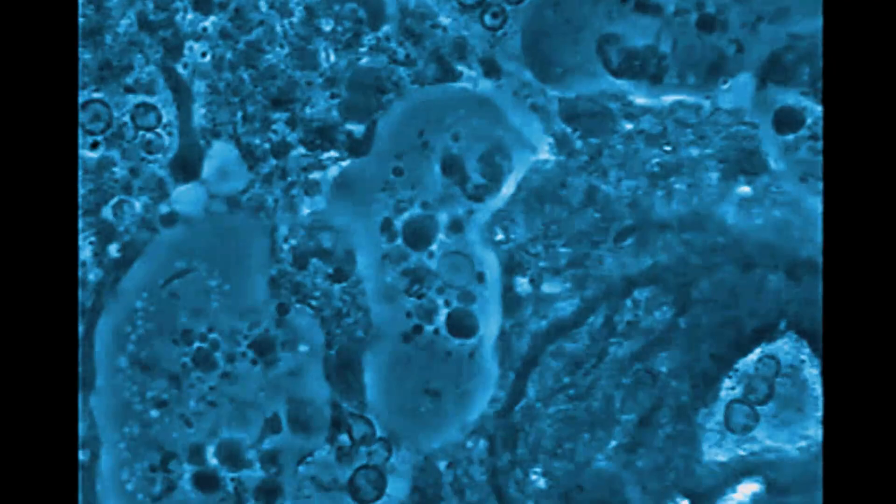Here is the images or a video film of a deep, very deep periodontal pocket during periodontal disease. In this case I had to definitively remove the last root of the upper molar because it was too deep. I'd say 12, maybe a little more millimeters deep.